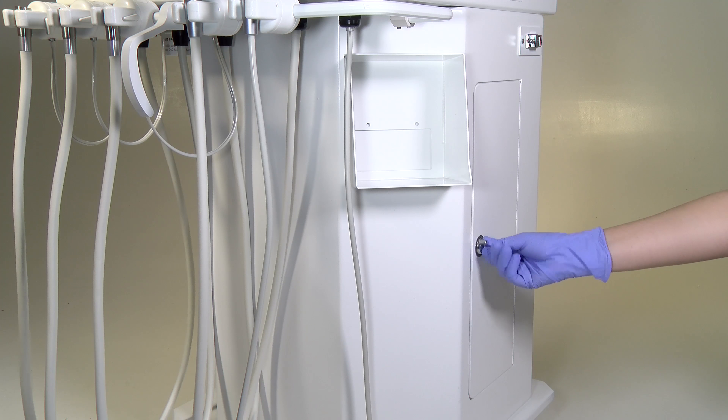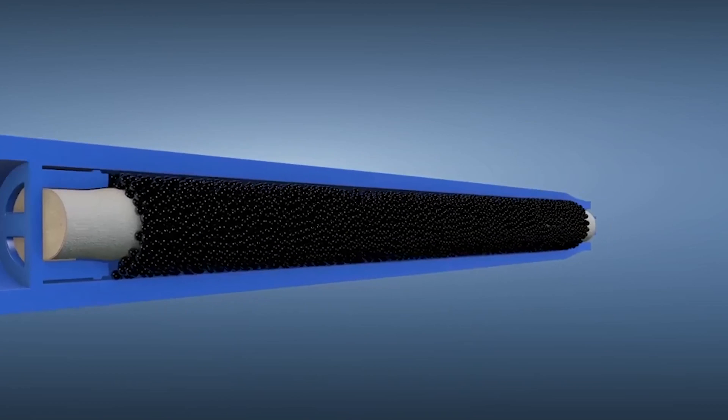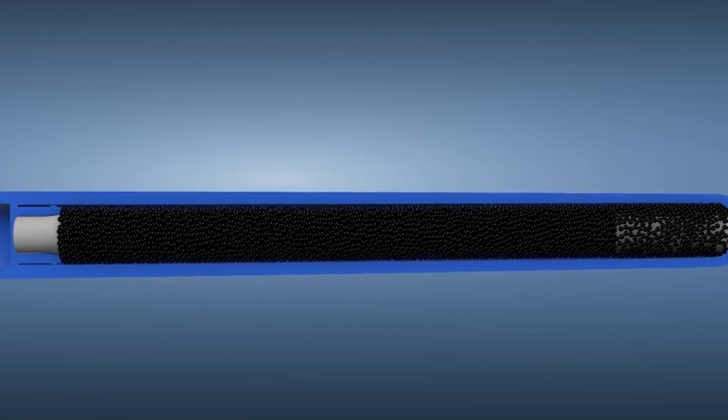The Classic Series features a 2 x 1-liter bottle system to provide ample supply for daily use and includes the DentaPure water line disinfection cartridge standard. The DentaPure system prohibits biofilm buildup in water lines while being safe for both the components of the cart and patient use.